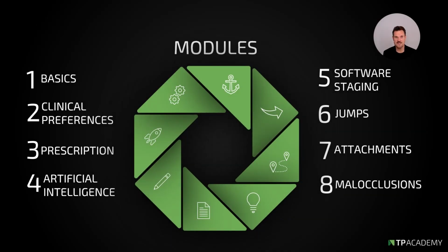Yes, and now we start with module number 1 with the basics for digital treatment planning in aligner orthodontics. And these basics are the most important input when you start treatment planning, but also if you have been doing it for years, to really understand what could be the effect to make my treatment plans even more predictable and to have fewer refinements, and also to reduce the treatment planning process and to make it much more efficient.